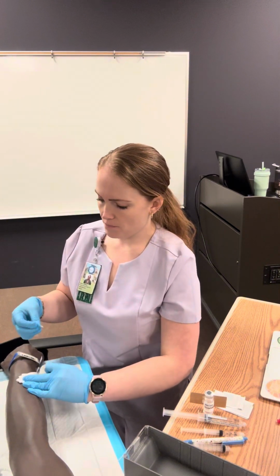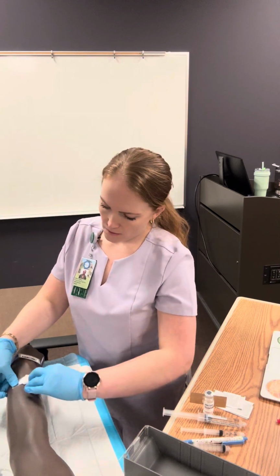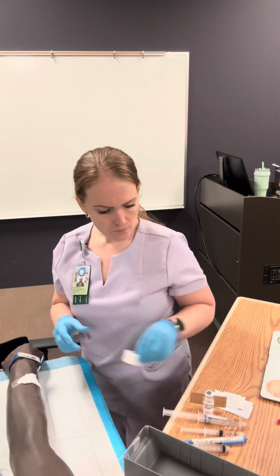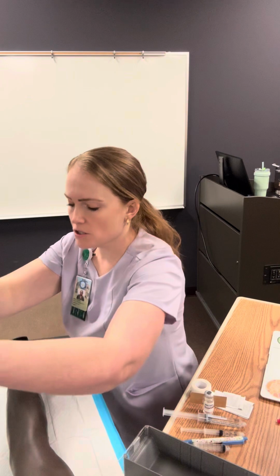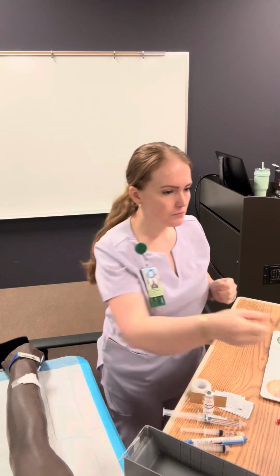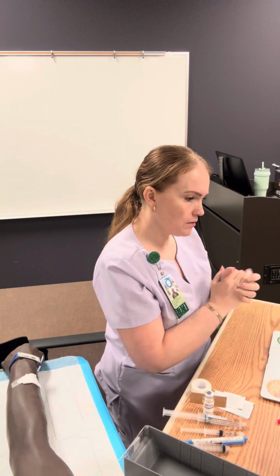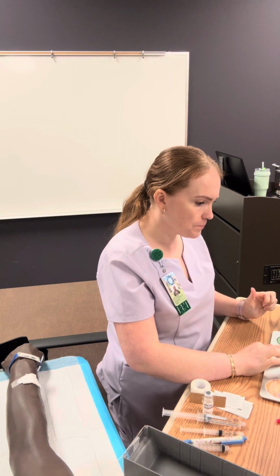My tape. Place that on nice and secure. All right, and I'm going to dispose of my medication, lines, remove my soiled gloves, perform hand hygiene. And I'm going to go in here to do my charting.